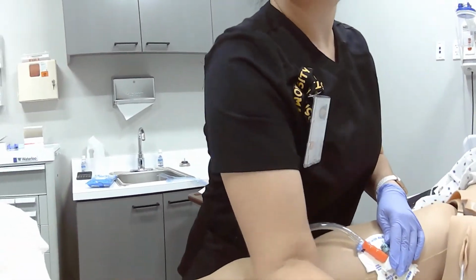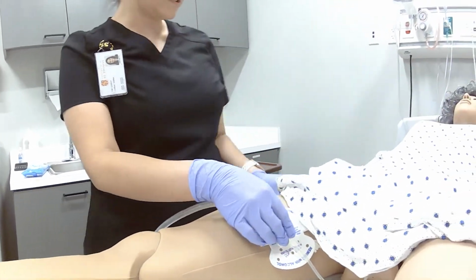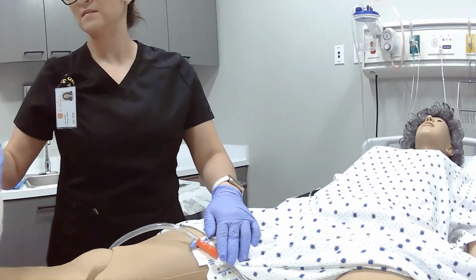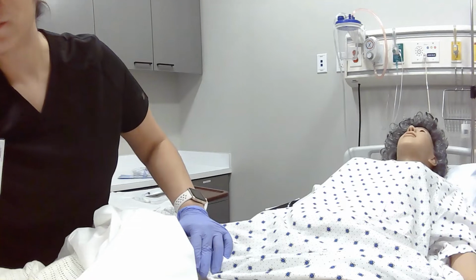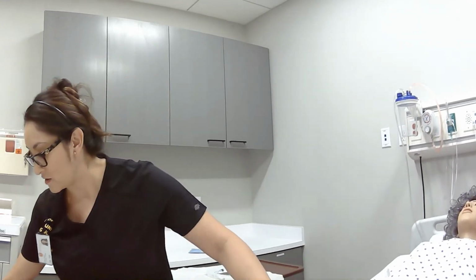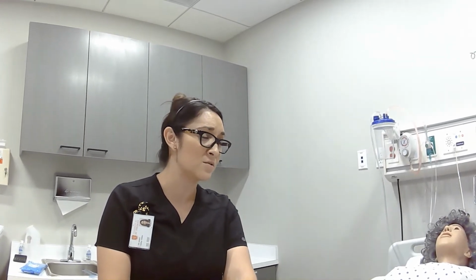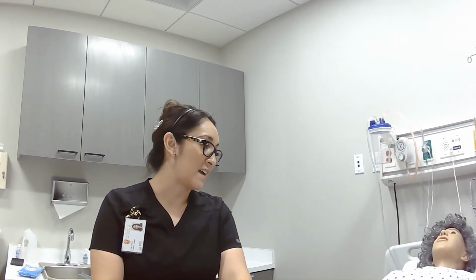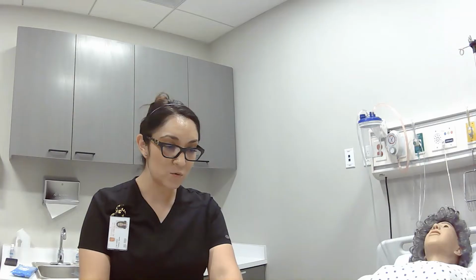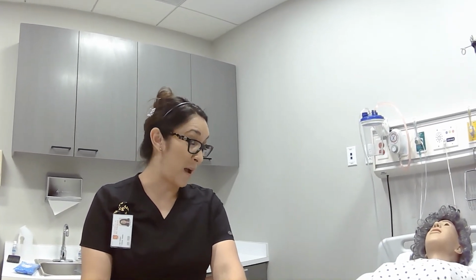And making sure that she is left in a comfortable position. Do you have any questions or any needs, Ms. Adams? No? So let me know if you start to feel any pain or discomfort, okay? Since the catheter itself is draining your urine, you might have the sensation that you need to go to the bathroom, that you need to pee or empty your bladder, but remember that you have that catheter, so it will collect the urine. Let us know if you do have to have a bowel movement.